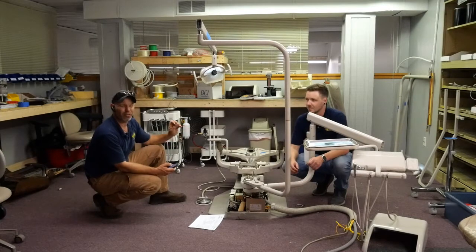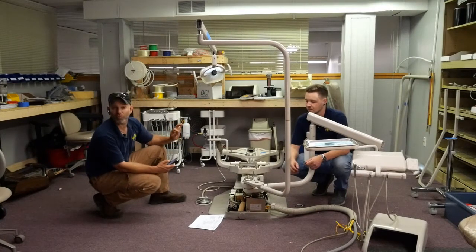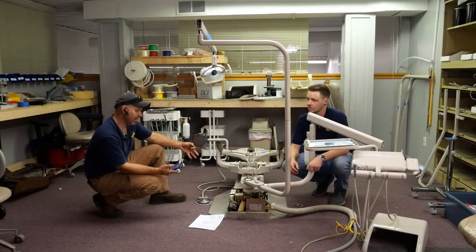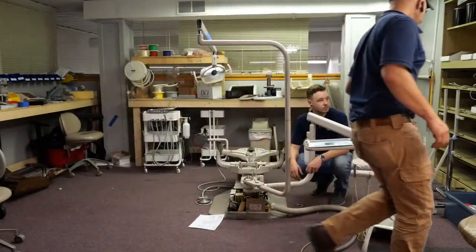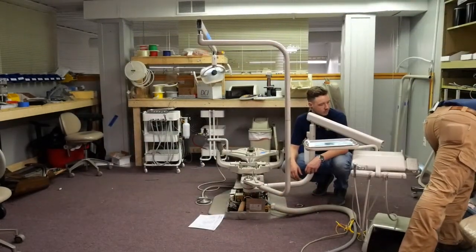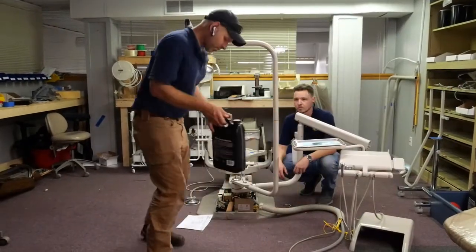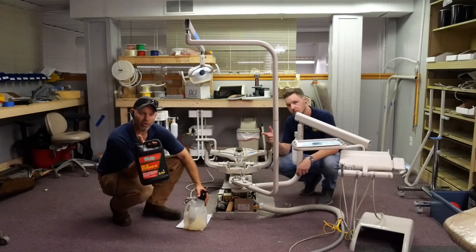Now, this is the third thing that I'm going to tell you, and this is one that I think is far more interesting than just reading the manual. What that tip is, this is the fluid that you'll probably want to go ahead and put in your chairs.